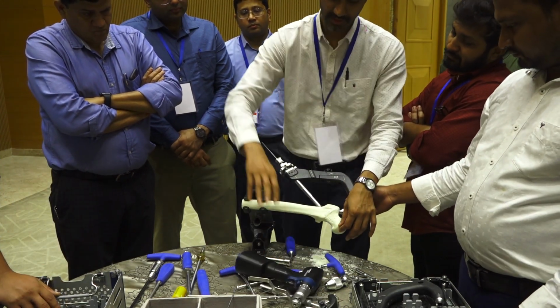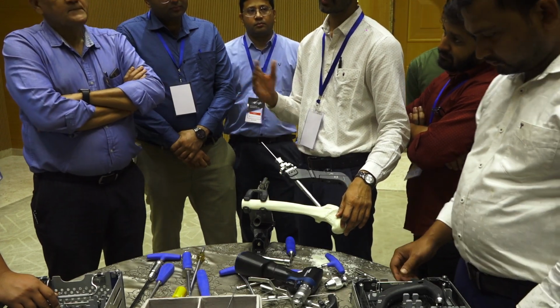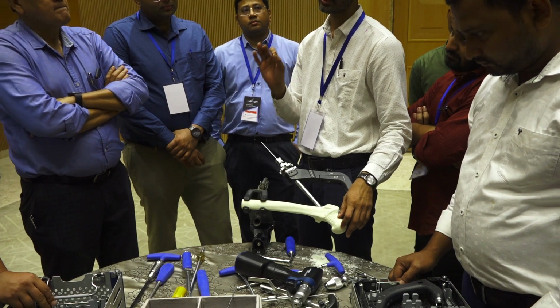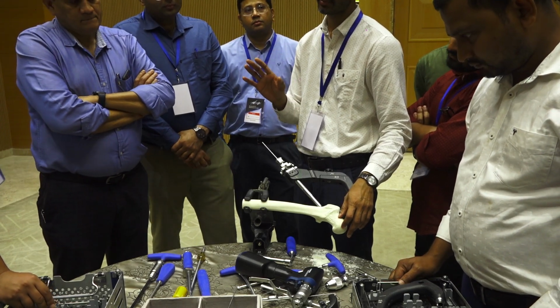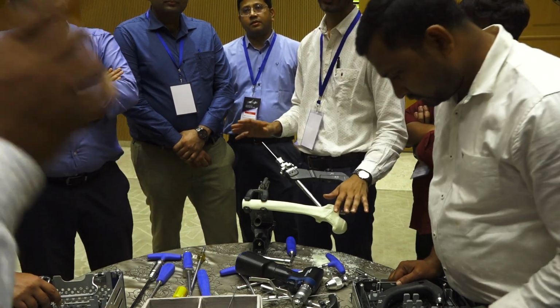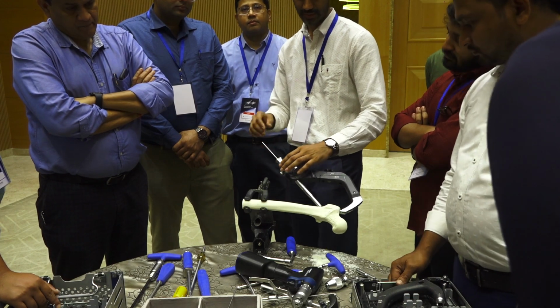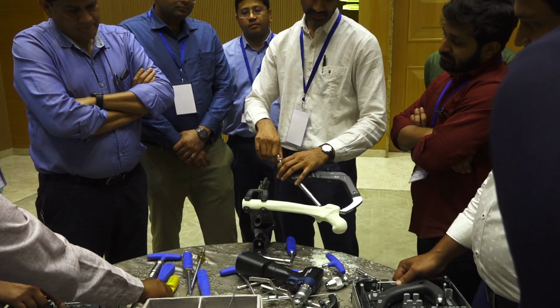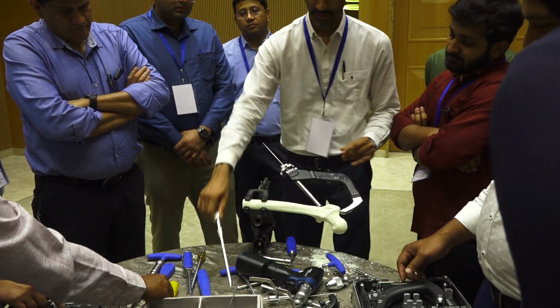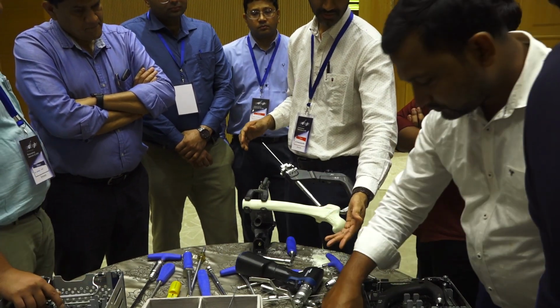So you check under C-arm the tip apex distance. Although in TFN or PFN it is not as important compared to DHS, ideally the tip apex distance should be less than 25 mm, in both AP and lateral. After putting this guide pin, you have to check under C-arm, and then even if it is a hard bone, you have to break the outer cortex.